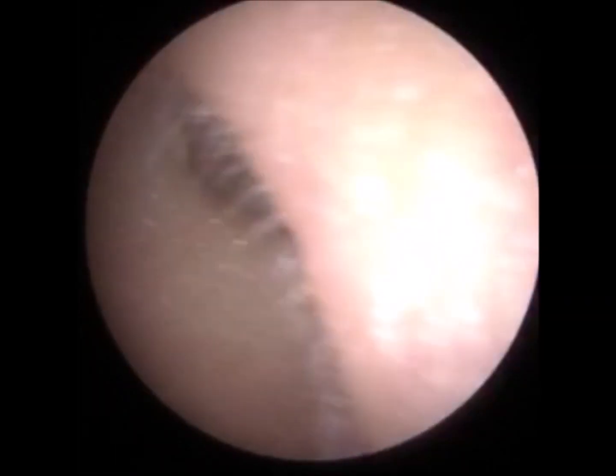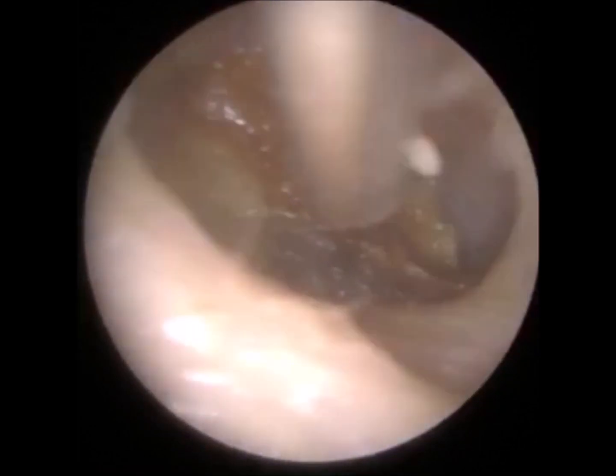I see. So therefore your brain thinks you're moving. So your eyes are just going to correct that. So probably the room's spinning at the moment. Yes. OK.